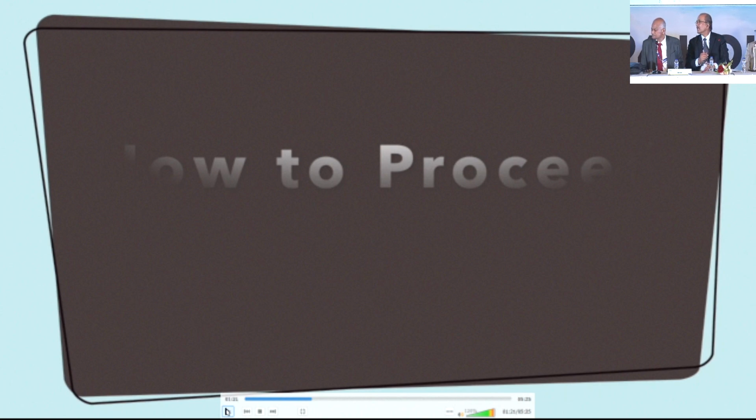Ragini. So basically, I think that the capsular bulge is there. What you have done is correct by changing the speculum, which was causing the pressure. And there is no iris prolapse or anything. Now, your problem is how to insert the IOL without causing a PC rent. Yes, ma'am. What you're using is correct, the cohesive viscoelastic, and to put in the IOL. I think you can go ahead and put in the IOL because the AC is formed right now and the bag is also inflated.